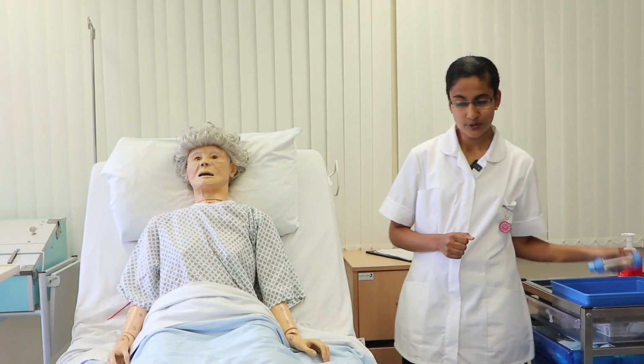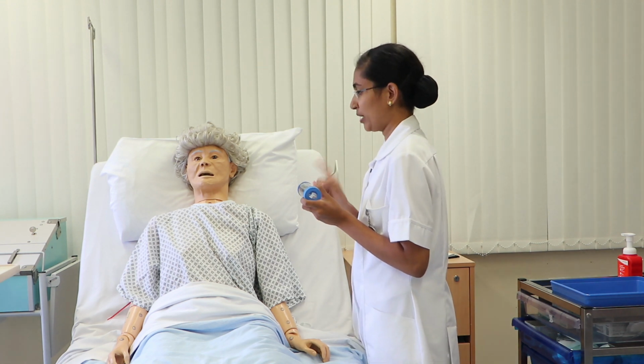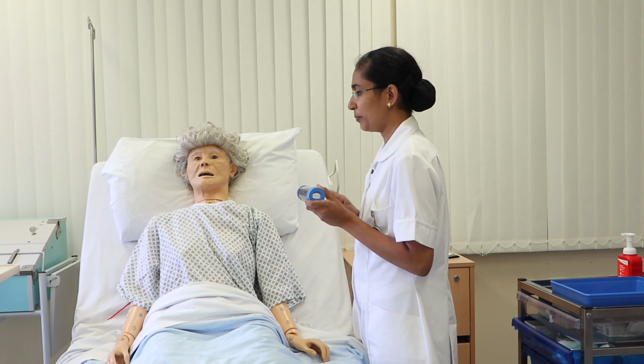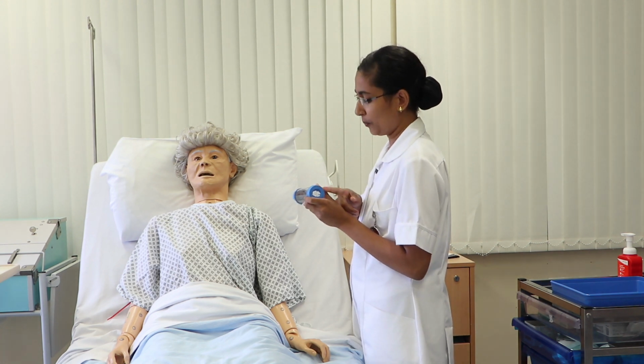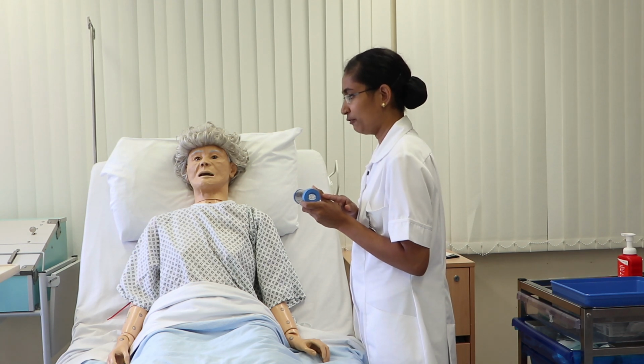First, I will introduce you to this aero chamber. It has a mouthpiece that I will put to your mouth, and there is a chamber. It will help to equally distribute the medication to your lungs, and the other part will be connected to your inhaled medication. Is that fine for you?